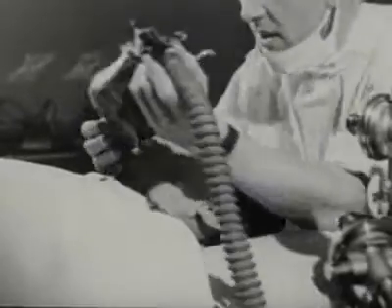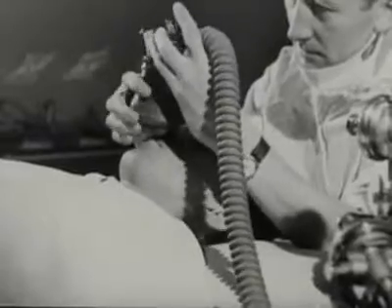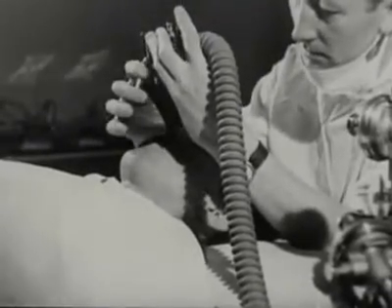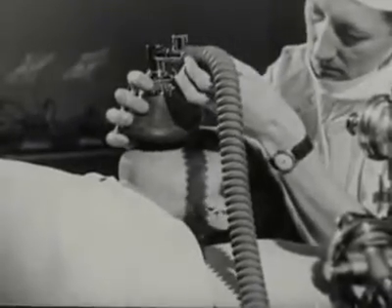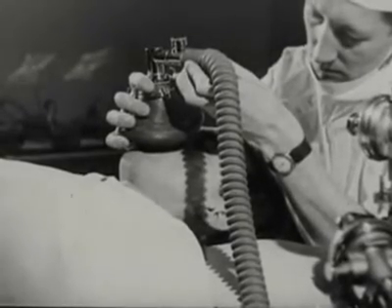Lower the mask gradually onto the patient's face. Induction will be slower this way, but much pleasanter. A mask held tightly on the face often produces a feeling of suffocation, which may lead to excitement in the second stage.